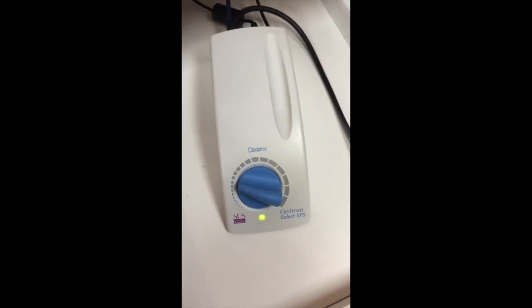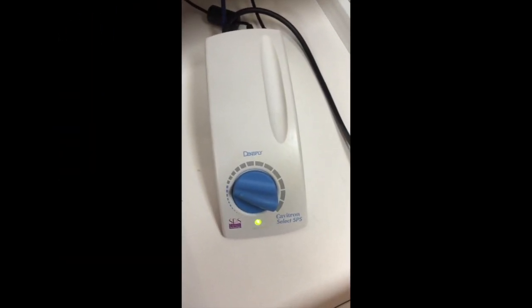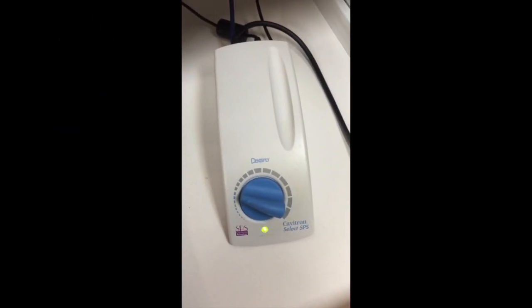Hey, it's William. Today, I'm going to tell you how to figure out why your Cavitron's not working. First thing you got to check is: is the light on? In this case, the light's on.